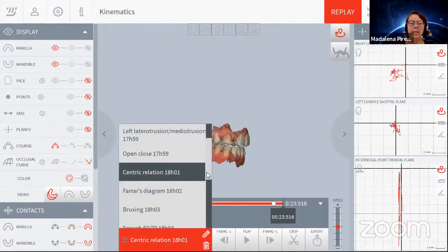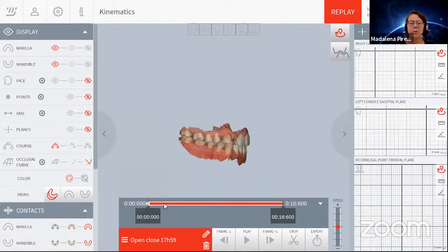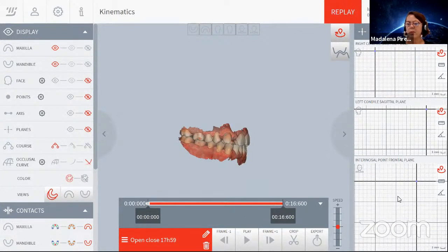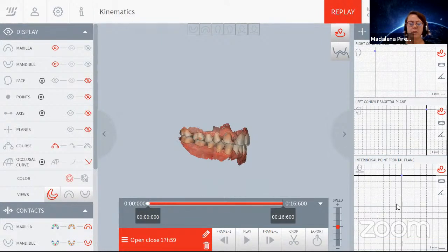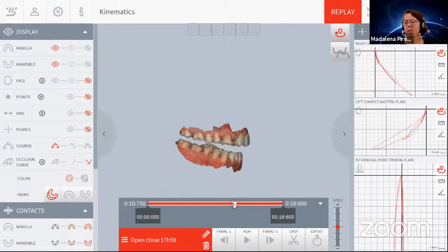And then with the opening and closing movement, open and close. So I said, okay, I decided through the centric movements that I want to open this bite by 2 millimeters. So then I'm going to perform the open close several times, and I'm going to see here the patient stabilizes and he's in a vertical, and usually we choose a closing movement.